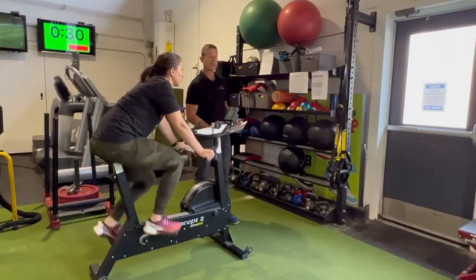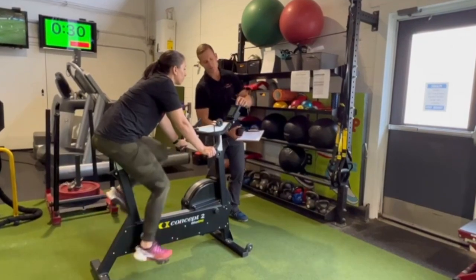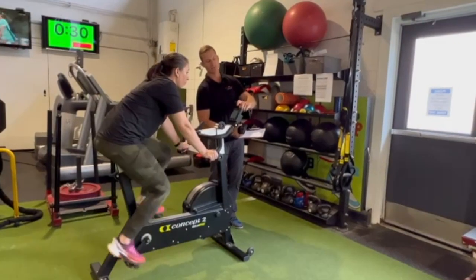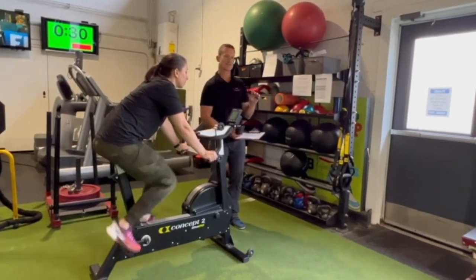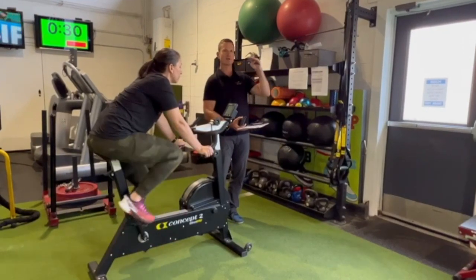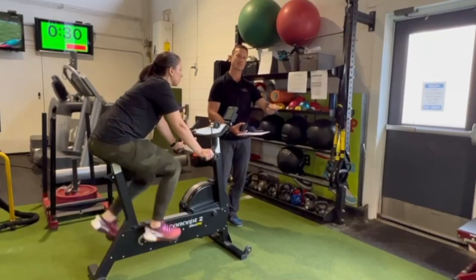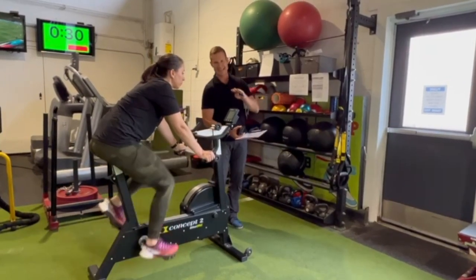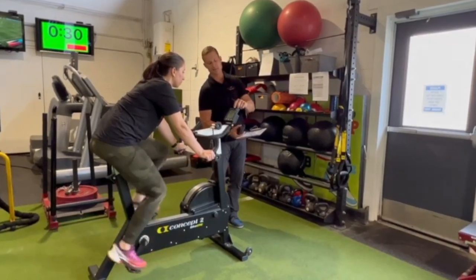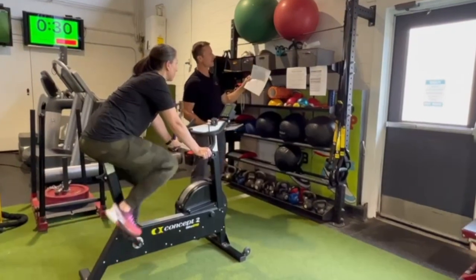So for the bike test, the cadence is going to always be between 60 and 70 RPM, which we can see on this Concept 2 screen. And the watts, or the power, which is the resistance, is slowly going to increase. So that differs from the treadmill. Instead of making it faster on the treadmill and more incline, we're keeping the cadence steady, but we're increasing the resistance. And specifically, the University of Buffalo group has identified a chart.